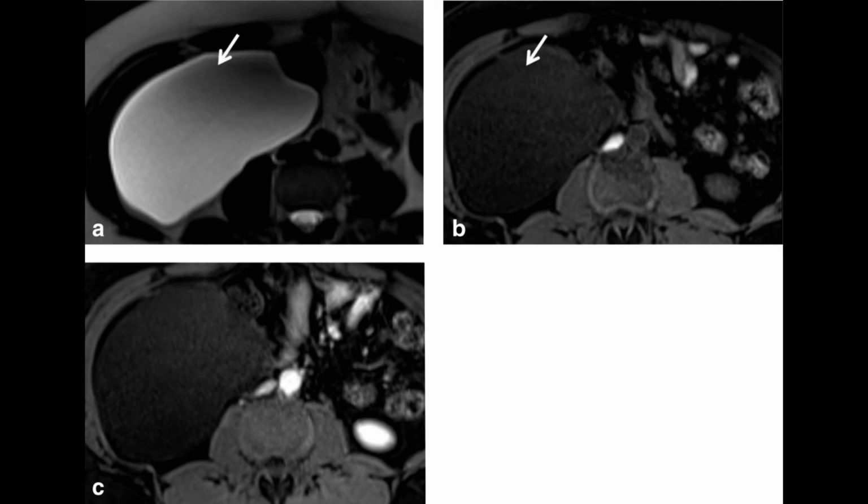Now again, if it is a solid tumor, again we see whether it is well defined, whether it is ill defined, whether it is a fat containing lesion. So this is how we go about the lesions in the mesentery.